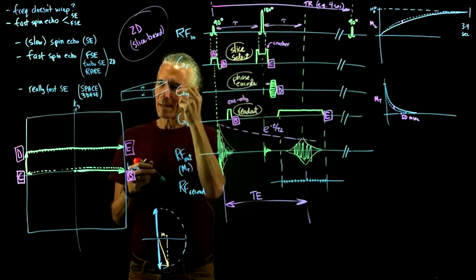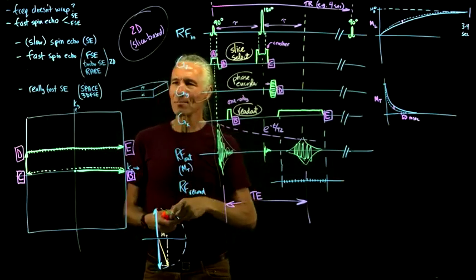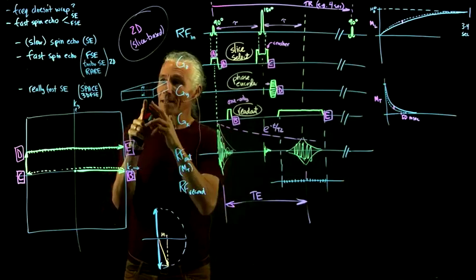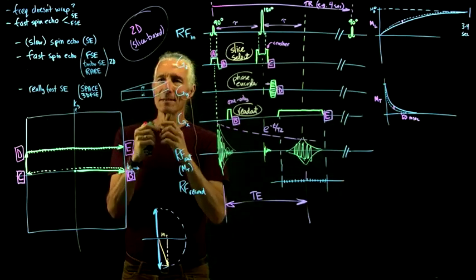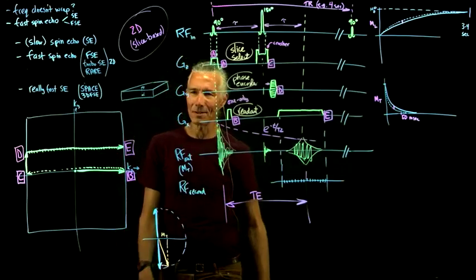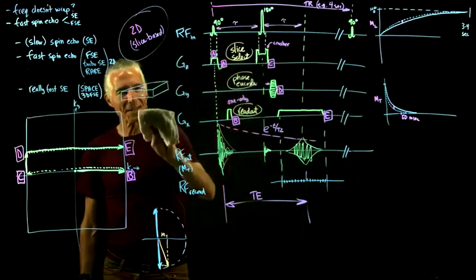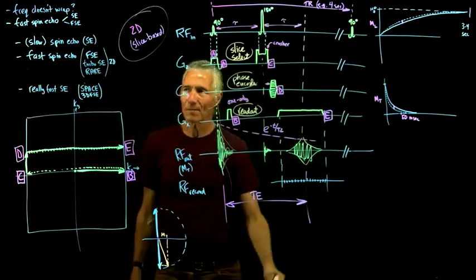Those things are kind of irrelevant. A tumor that's actually going to cause some problem in your brain is going to be a chunky thing. And so when you take a relatively thick slice, it smears out all the other details. That's one reason why radiologists still like to look at these thick slices, even though we can make much thinner slices now, because it blurs out the unnecessary detail. And there's a big chunk here that I can see that survived blurring those slices. Like I said, these scans are still used, but not too much anymore because they take so long, 45 minutes just for one scan.